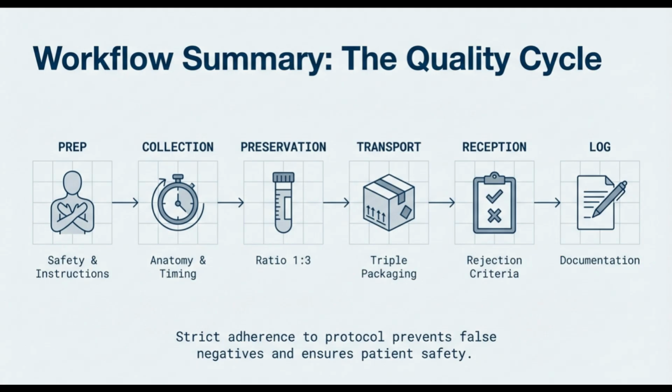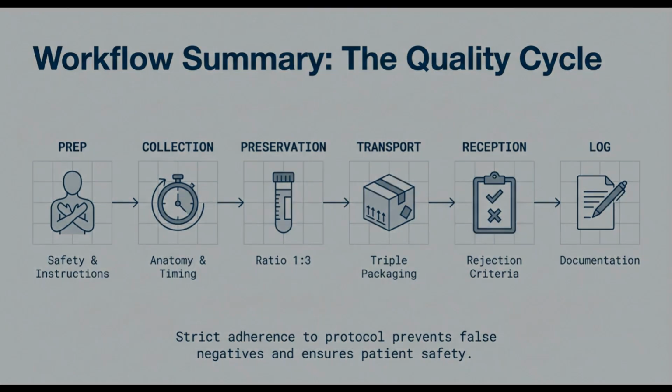And as the statement at the bottom says, strict adherence to this entire protocol is what prevents false negatives and, most importantly, ensures patient safety. Every single step is a critical link in that chain.